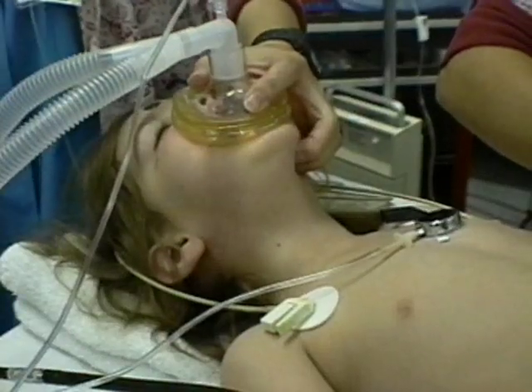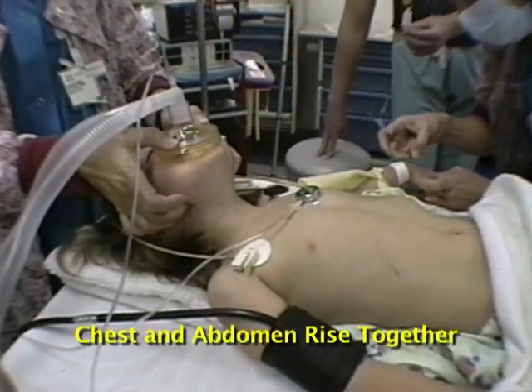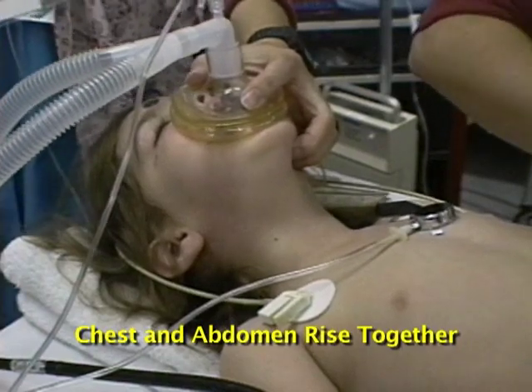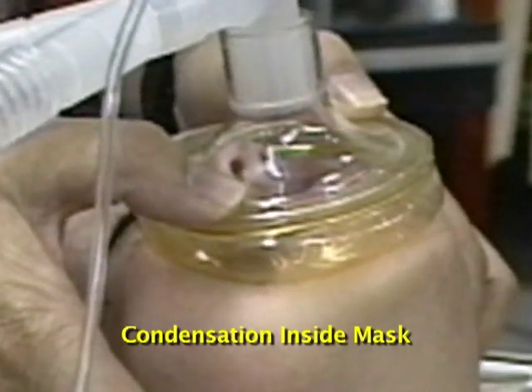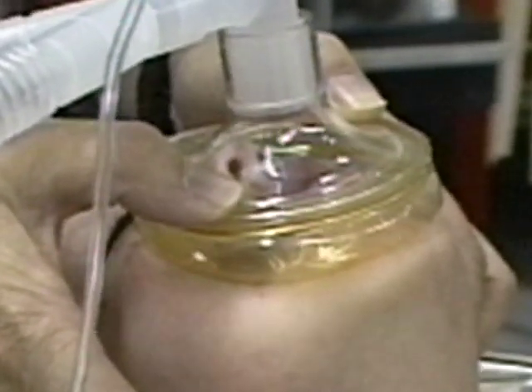Look at the difference in chest wall motion now that obstruction is relieved. The chest and often the child's abdomen rise together with inspiration. Breath sounds are heard on auscultation. Air movement returns. When a clear mask is used, this air movement is seen as condensation inside the mask.